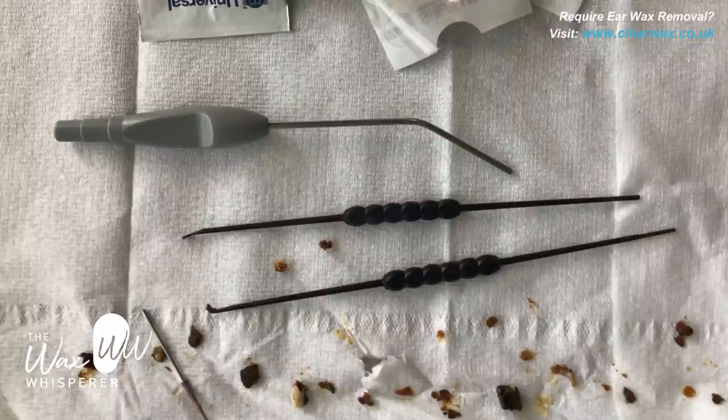Ear irrigation also requires softening the ear wax with drops — sodium bicarbonate, hydrogen peroxide — typically for 10 days, twice a day. This can exacerbate symptoms because the wax absorbs the drops, swells, and expands. If you're a hearing aid wearer, it's more difficult — you may not be able to wear your hearing aid during that time. Ear irrigation is also quite noisy. I've actually had it done myself, as my previous co-founder of Clearwax, Mr. Darish Rajani — who is an ENT surgeon — and I believe it's important as a clinical ear care specialist to have these procedures performed on yourself so you know what the patient experiences.